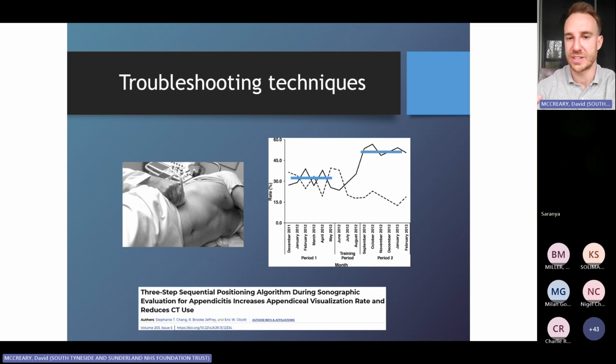If I've spent 5 minutes talking to a child, getting to know them, understanding if they are hungry, how the pain is doing now, and if I'm scanning for 5 or 6 minutes, or even 3 or 4, and I'm not finding what I expect to find, I would be fairly confident saying that's not appendicitis. And what we've started doing more commonly, myself and my colleague, is calculating a pediatric appendicitis score, but we're actually not getting to the point of doing the bloods. I appreciate that's not a validated measure for a PAS score, but we're saying the pre-PAS score would be 3 points so far out of 8. We normally need a white count and neutrophils, but we're not bleeding them because I'm sending all of these kids home. And so far, in terms of any false negatives, there haven't been any. So I do think it really works in this sense. Whilst you can use these methods, I don't think they're completely essential.